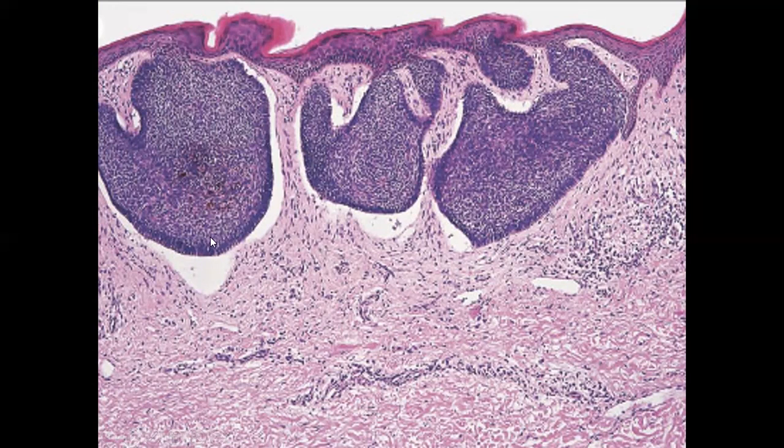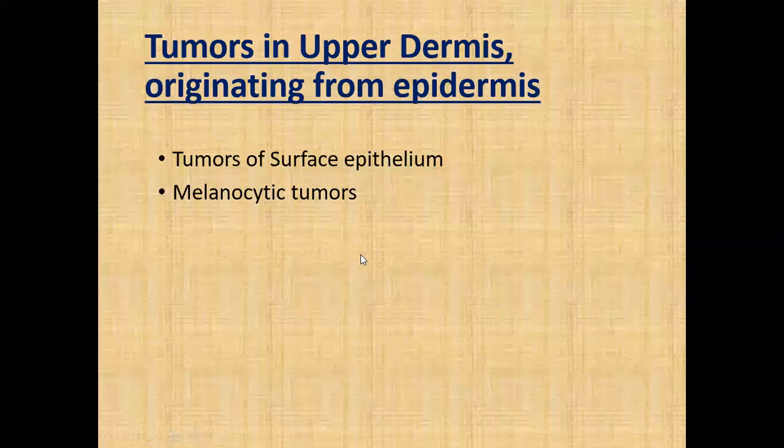Retraction artifact means that the tumor contracts, because the cells that make up the BCC or basal cell carcinoma don't have any desmosomal connection. So once these nests are formed, they jumble up, as a result of which they lose the space between the stroma, and they contract. The open space between these malignant cells and the stroma is called the retraction artifact.